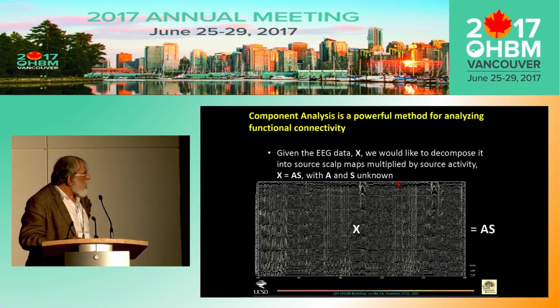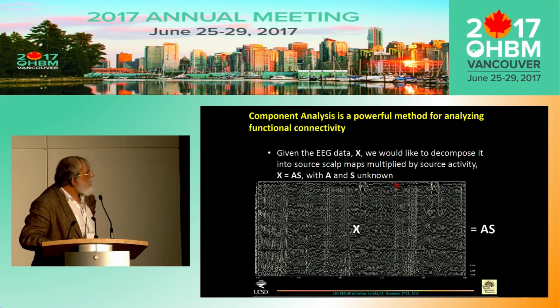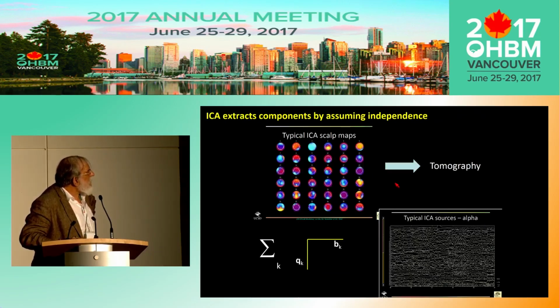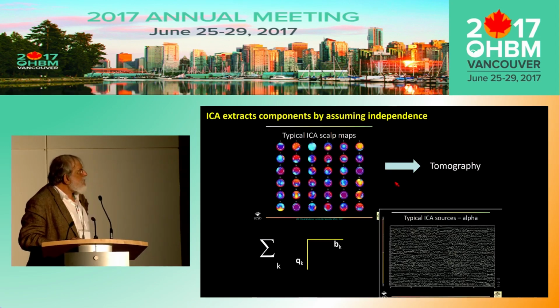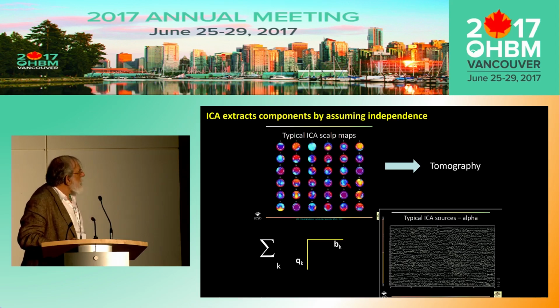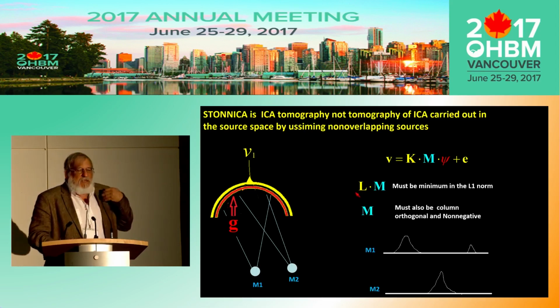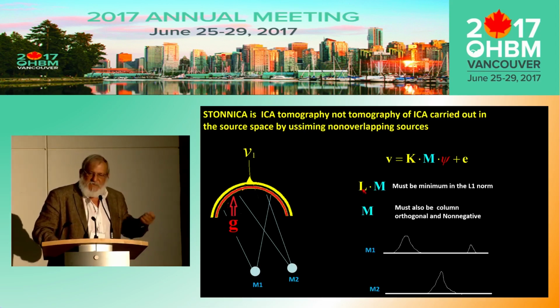A prime example which has inspired us all is independent component analysis. I'm just taking from one of Scott's lectures the idea that you can decompose, not by using principal components, which is then subject to arbitrary rotations, but by imposing independence, and he's argued eloquently for this approach. You can decompose a resting state alpha rhythm into components, and then you can carry out the sort of source localization. We have an approach we think is complementary, because what Scott does is he does independent components and then finds the sources. I think we can do both at the same time.